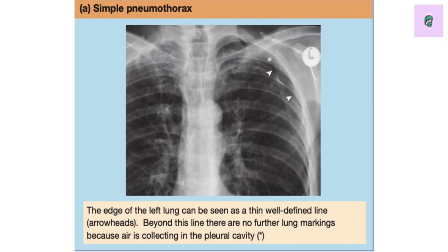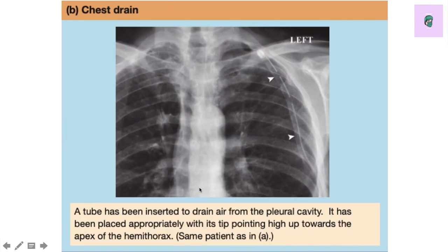First: simple pneumothorax. You can see the wedge at the edge of the left lung. Look at the arrowhead and the asterisk — the asterisk area shows no lung markings, which indicates pneumothorax. However, there is no mediastinal shift, and there would be no hemodynamically unstable patient history, so this is a simple pneumothorax.